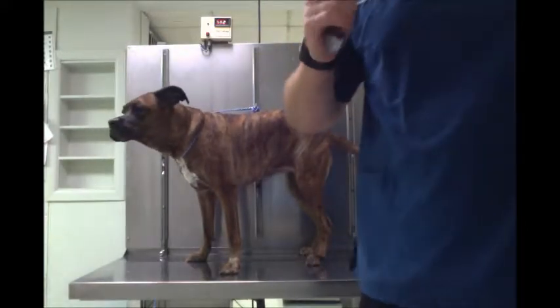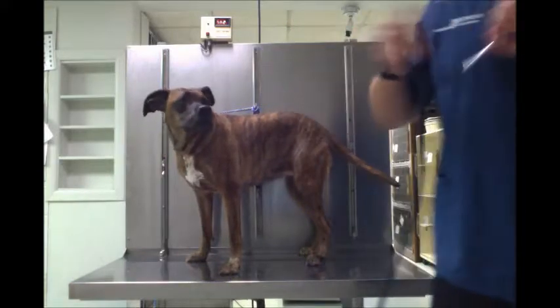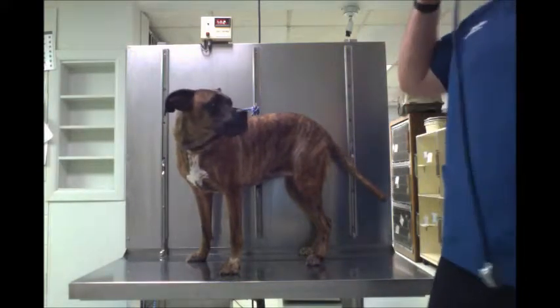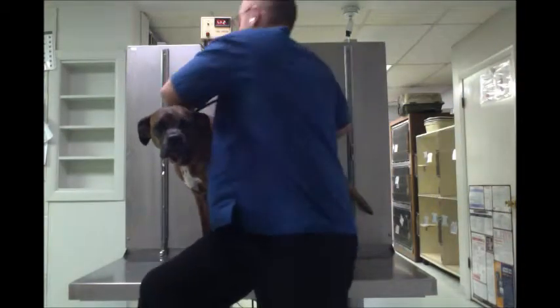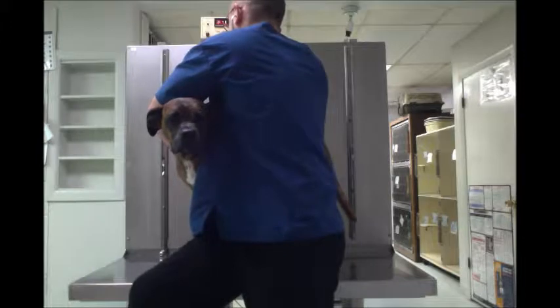I'm going to listen to her heart and lungs, and then I'm going to assess her an ASA grade. So we'll take a heart rate first on the left side. We're going to count for 15 seconds here.